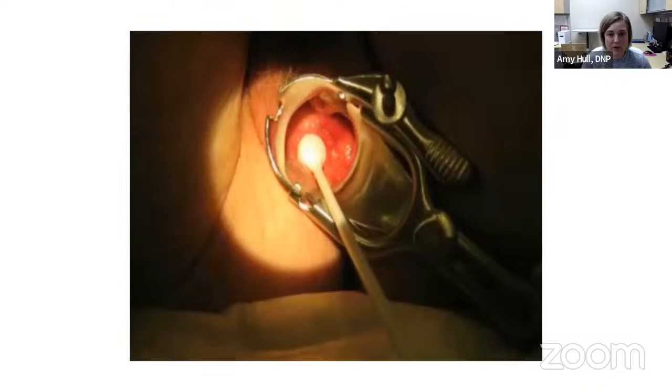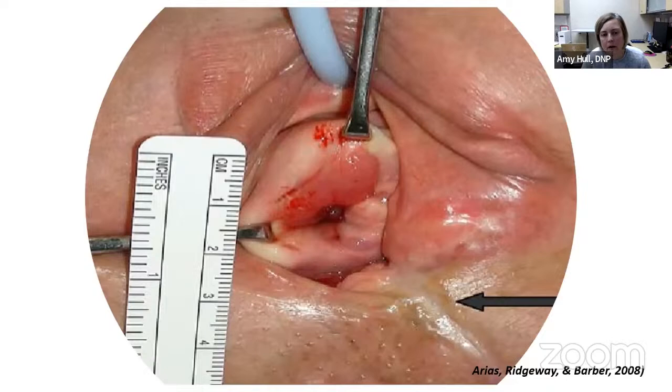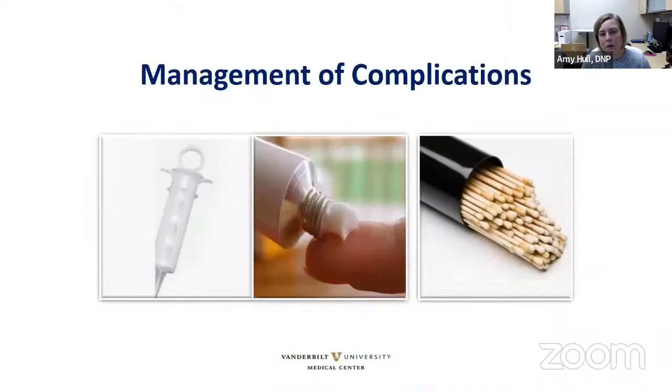And then we've got one here with also a little bit of granulation in there that they're seeing. This patient's in the operating room. I don't know if these authors had to take the pessary to the OR to remove it, or if they're now just going to repair her prolapse, don't know. So for management of complications, typically we use a lot of silver nitrate, a lot of local estrogen, and sometimes we'll use our 60cc piston syringe to irrigate the vagina a little bit, maybe with some normal saline to see if that'll help with some of that discharge.